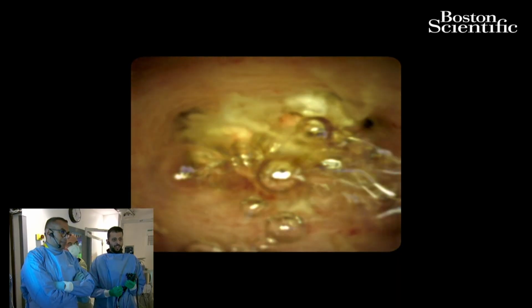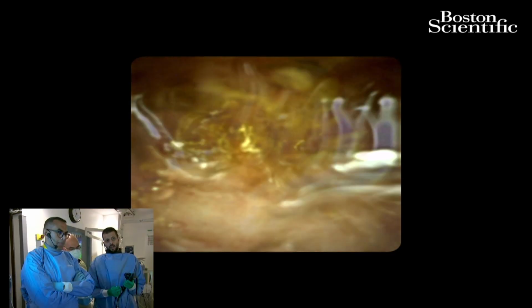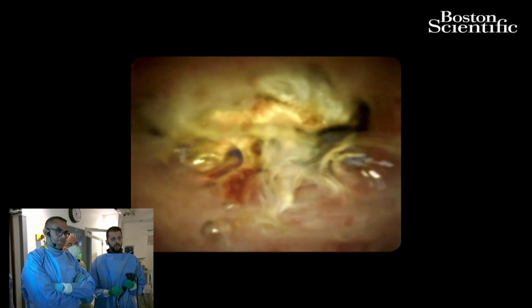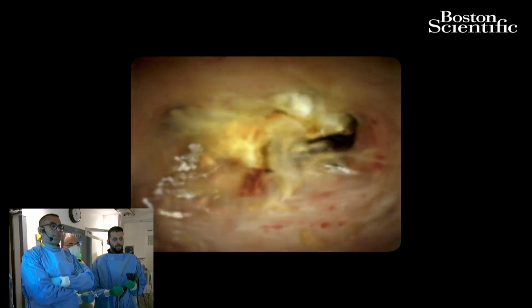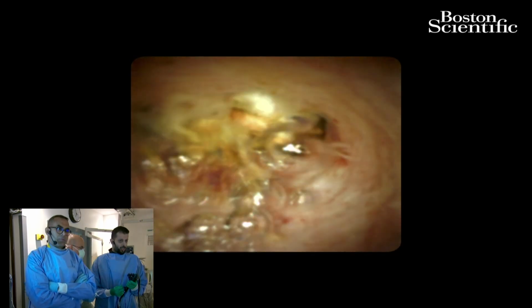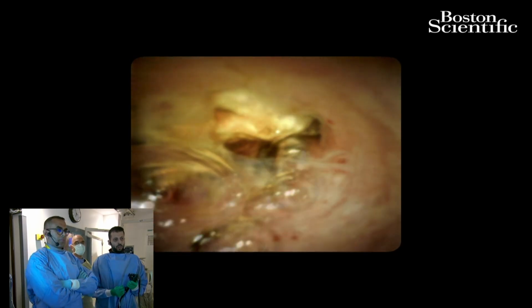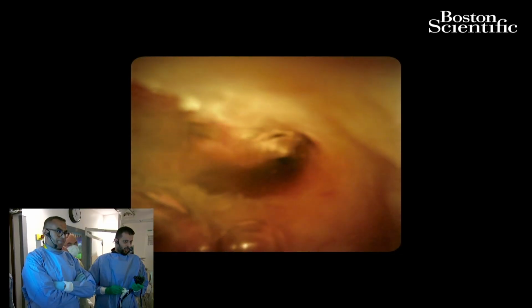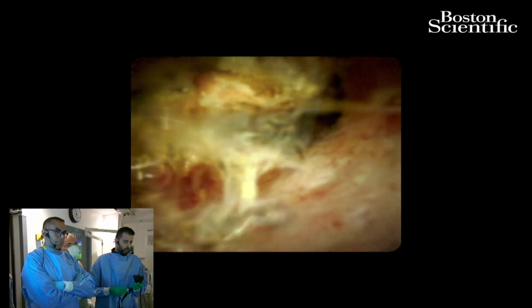Yeah, it's a good question. I remember I spoke to one of my mentors earlier on. He says, we keep talking about how many passes we do on EUS FNB, but no one ever talks about how many brushes we take. Even though the brushes are not that expensive, we all know from data that brush diagnostic yield is around 35%. So it's not that great, especially in the era of EUS.